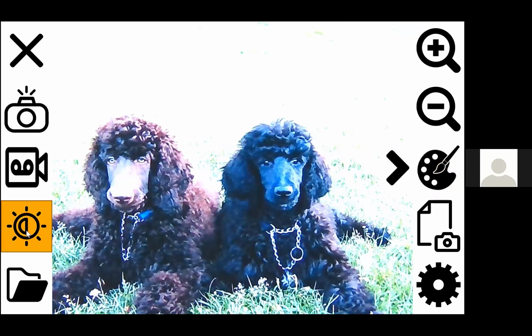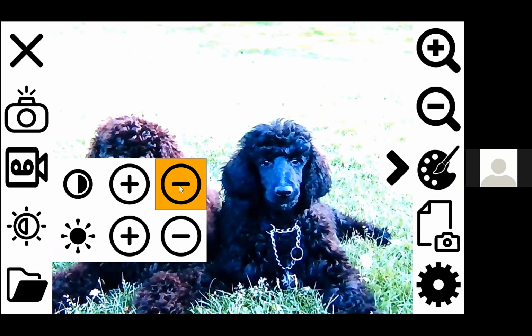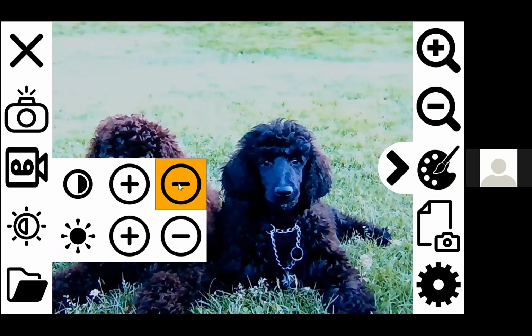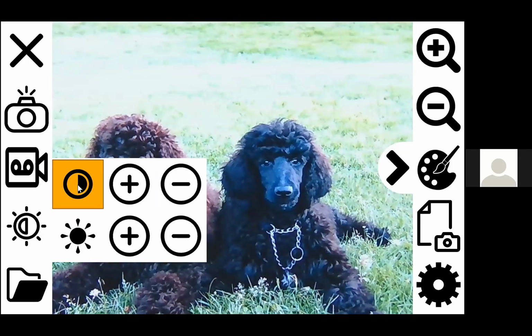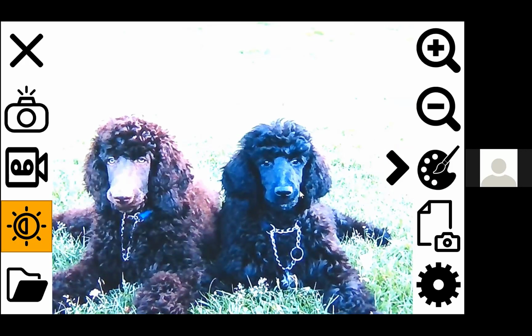And if it's too bright, I just come over here and I can decrease my brightness and I can customize this. And I can also decrease any of the contrast if I want to. And if at any moment you find, oh, I went too far, you'll notice here, and there's a little lag again, don't forget over Zoom. If I notice at any time that I went too far, I can actually just click on the icon here on the left, whether it be the contrast or brightness, and that'll bring me back to the default. And then to go back to your regular image, just click on that option again on the menu. Yep. And then you can toggle.